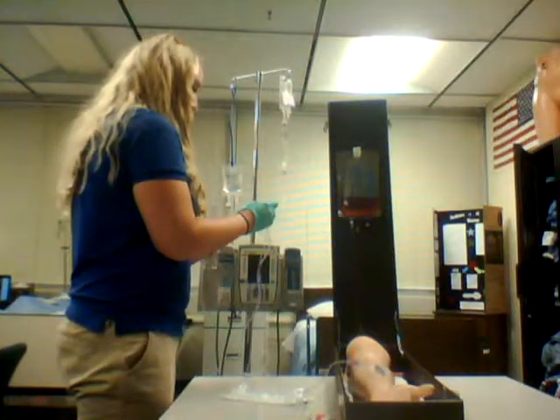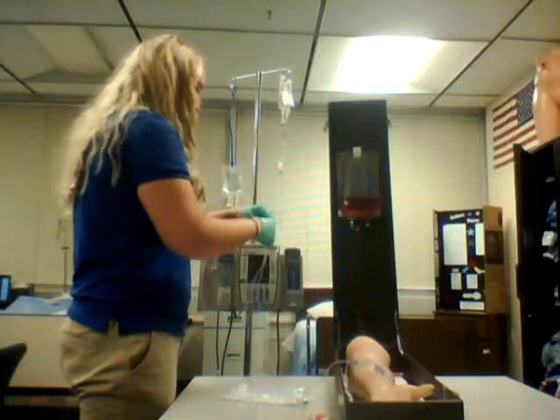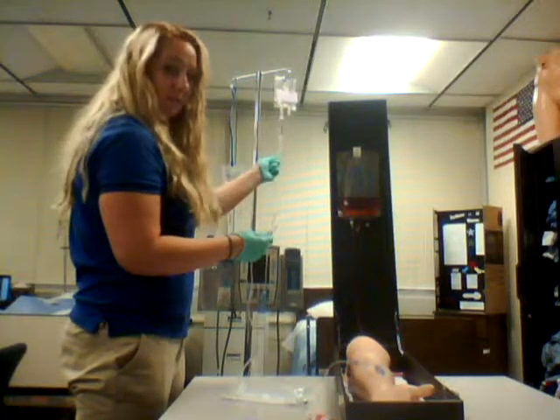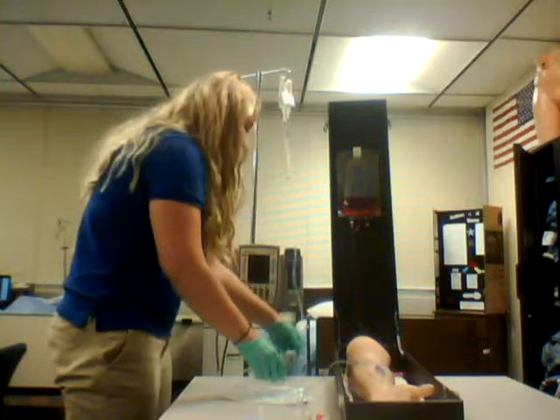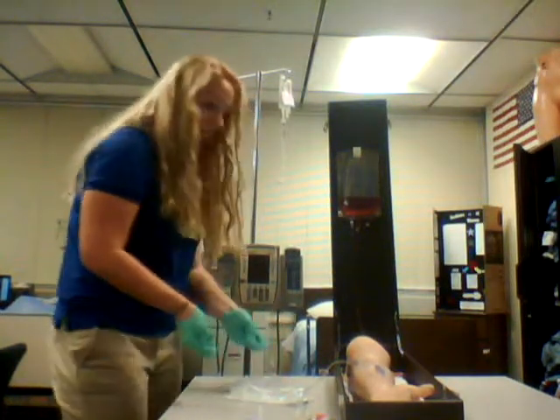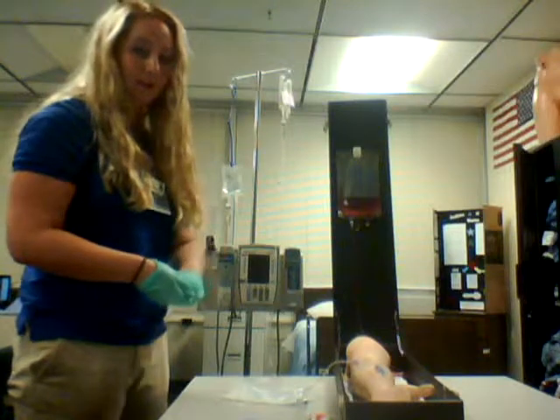Now a couple of things I'm going to be looking for is I'm going to be looking to see if there's any sedimentation. If any sedimentation starts, I'm going to immediately stop the entire IV. I'm going to unclamp it and establish the flow rate, which is 17 drops per minute. At the end, after the medication has been administered, I'm going to disconnect the tube, gather up all my supplies, throw it away, and then I'm going to come back and see that the medication is done.